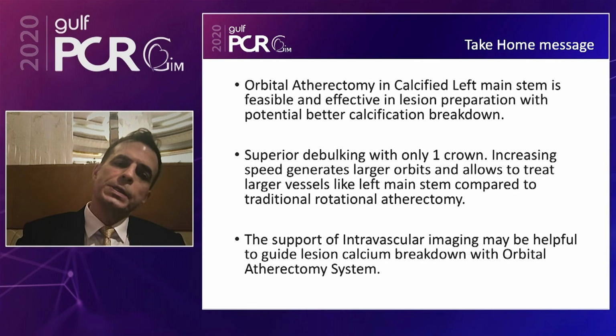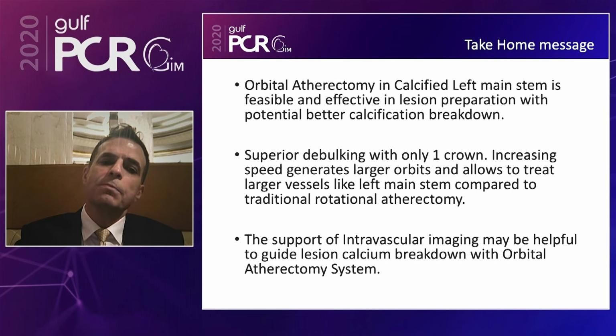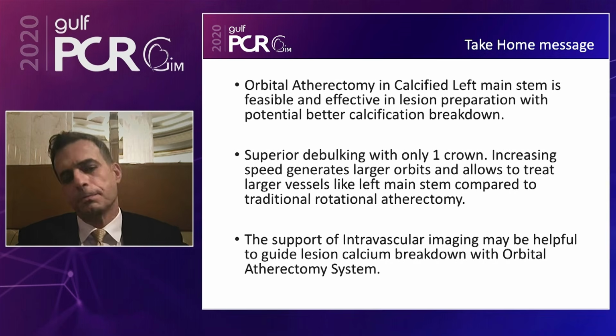The final one is that the support of intravascular imaging may be helpful to guide lesion calcium breakdown with the orbital atherectomy system. I think using intravascular imaging becomes mandatory in left main stem.